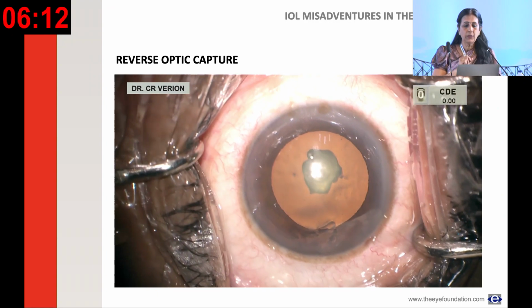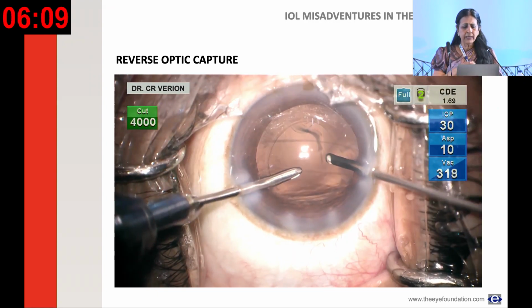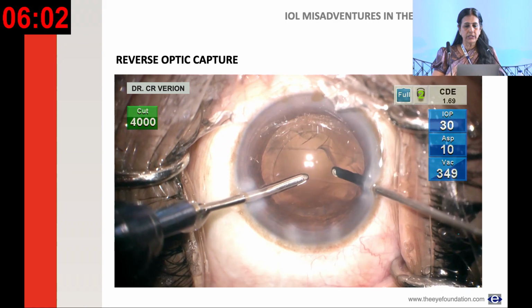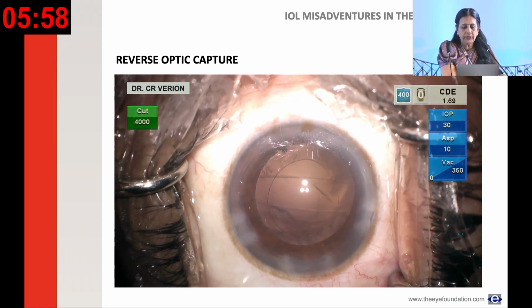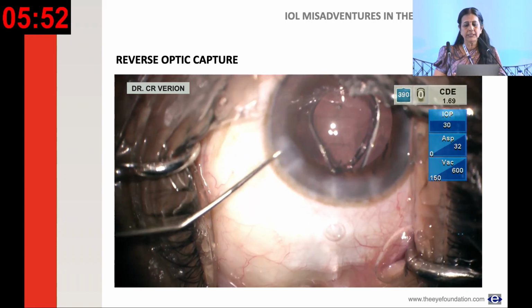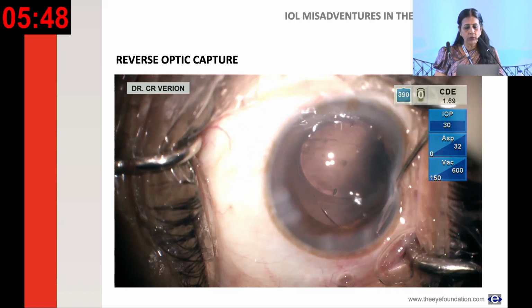Now, this is another way of bailing out of the situation, a polar cataract, and we do know that in a polar cataract, suddenly you could have a PCR. So you need to do adequate vitrectomy, ensure there's no vitreous. Always inject diluted Tricot, 1:10 is how I would dilute it, and then check on it. And then the plan of action again. Now again, I have challenged myself that I need to have a toric IOL for this patient, and toric IOLs come only in a single piece.